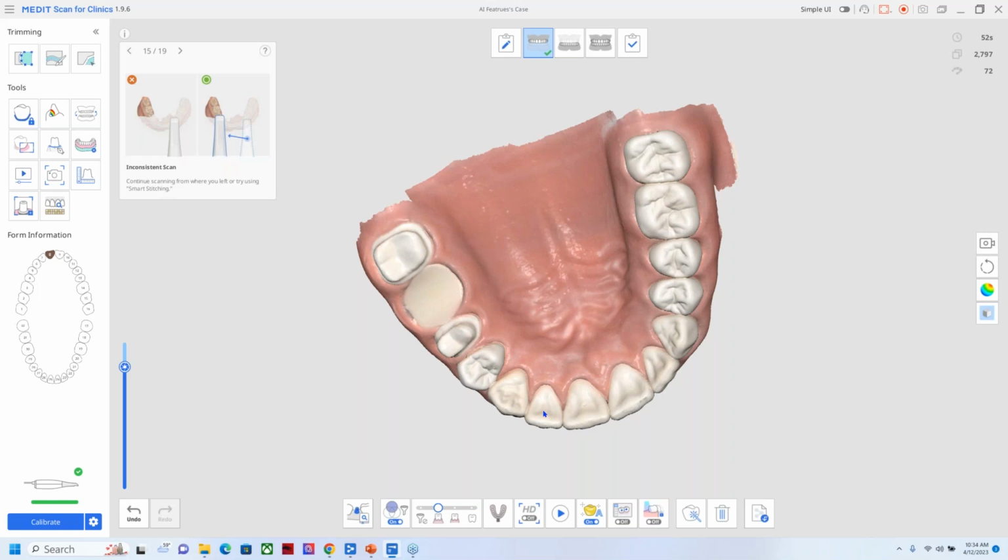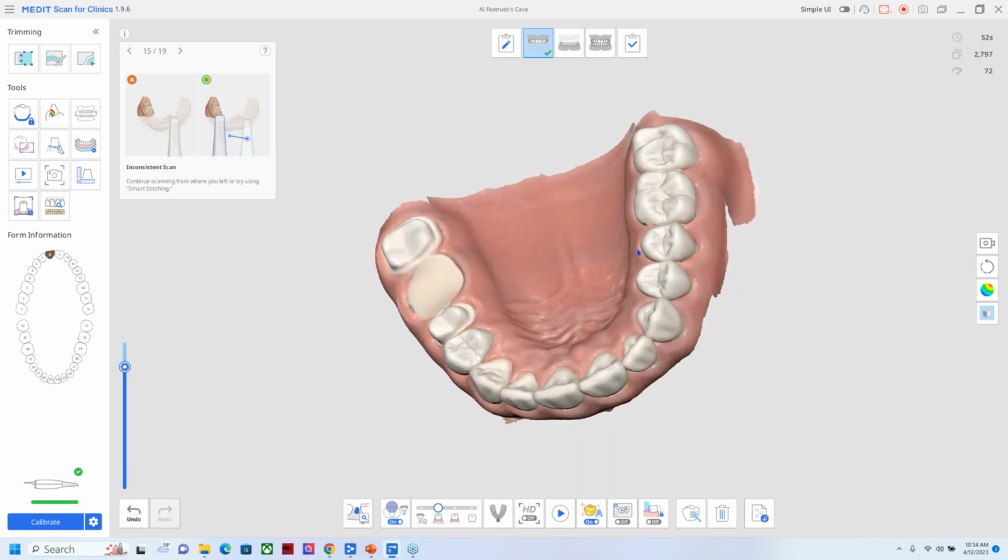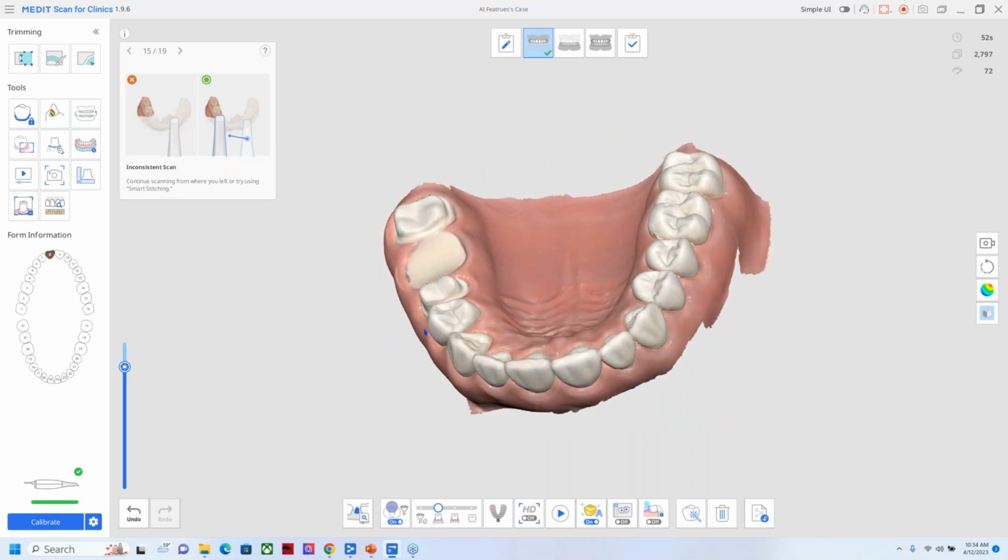As you use the scanner more and more, obviously it becomes easier and easier to use, and you know what to anticipate and exactly what scan technique you need to do. But this offers beginners prompts and guidance as they get better and better. Okay, so that was the Smart Scan Guide. And remember, notifications pop up, prompting the end user, just like a GPS navigation unit.